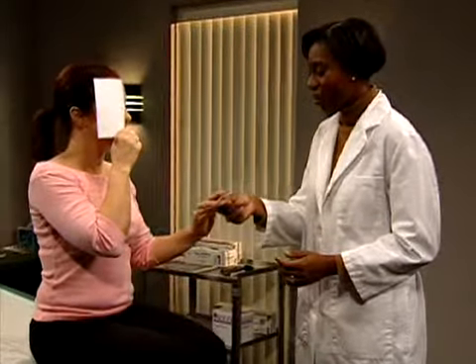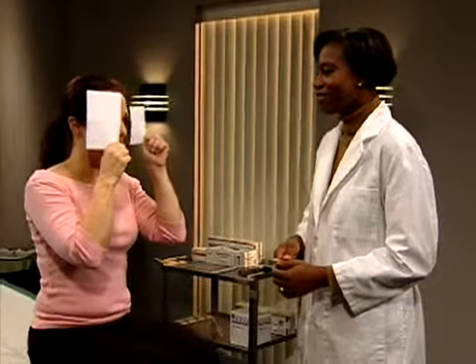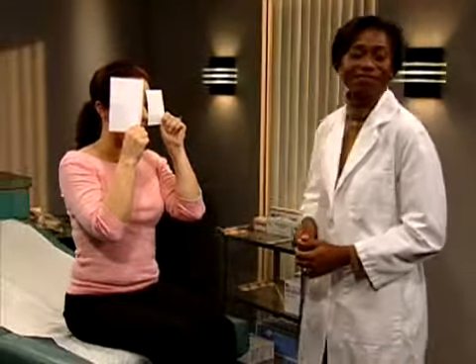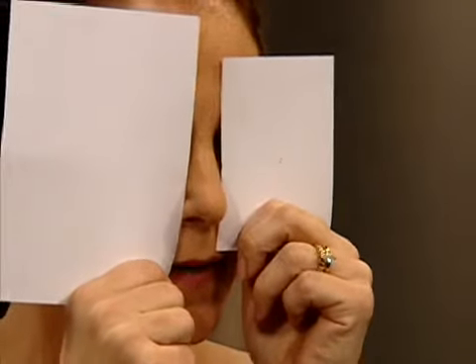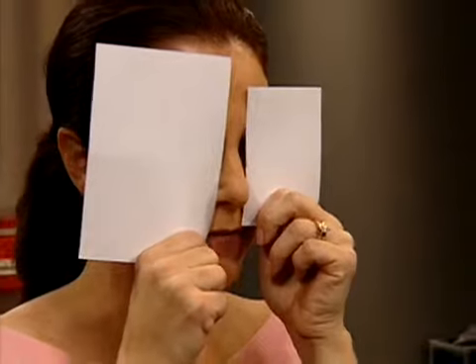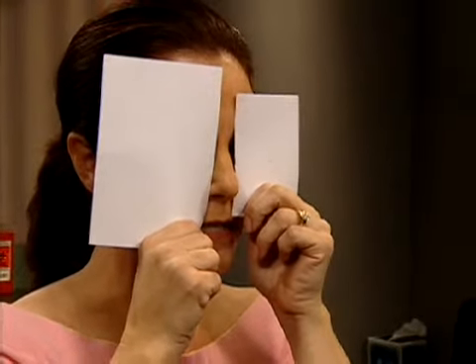Now cover your right eye with the card. If the patient's distance vision is less than 20/20, have her hold a card with a small pinhole over the uncovered eye and read the chart again. If visual acuity was reduced by a refractive error, this should improve acuity by at least one line. T-E-C.